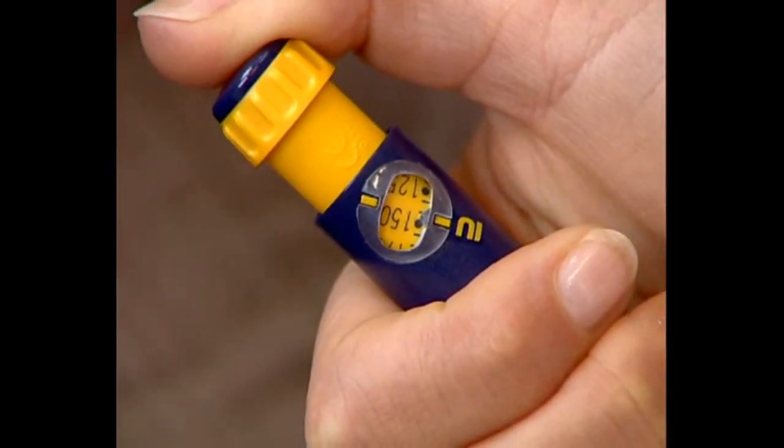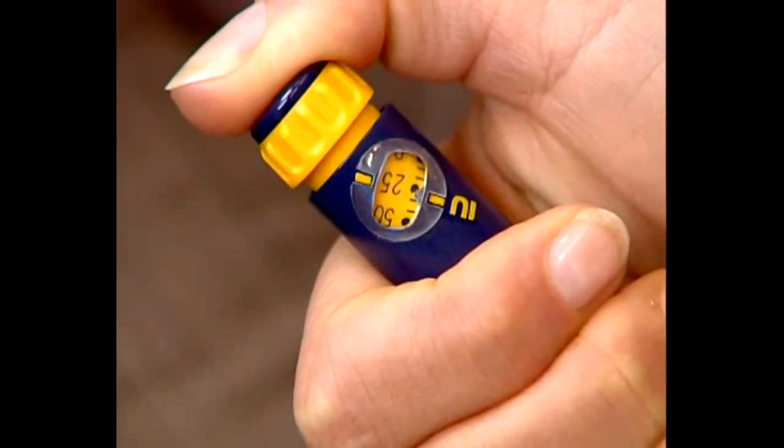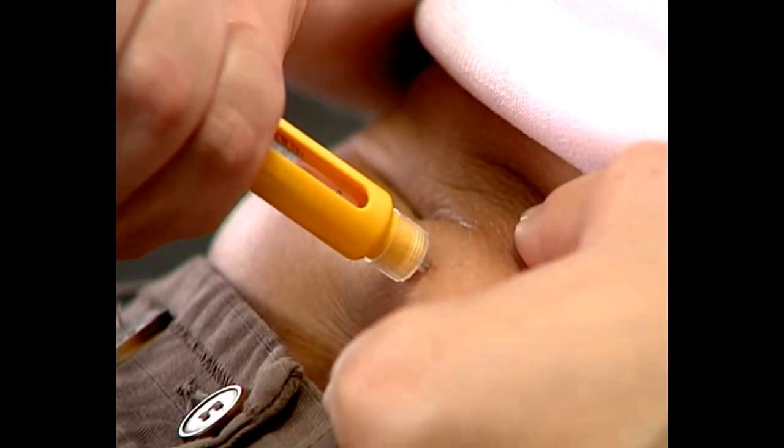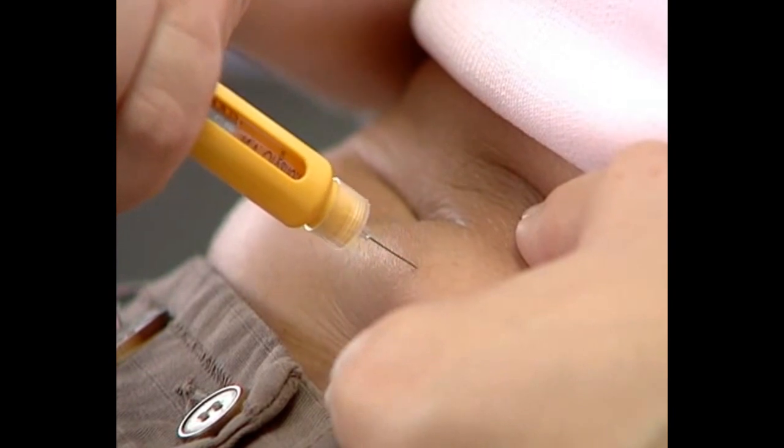Fully press the end of the injection button. Wait five seconds before removing the needle from the skin, then pull out the needle.